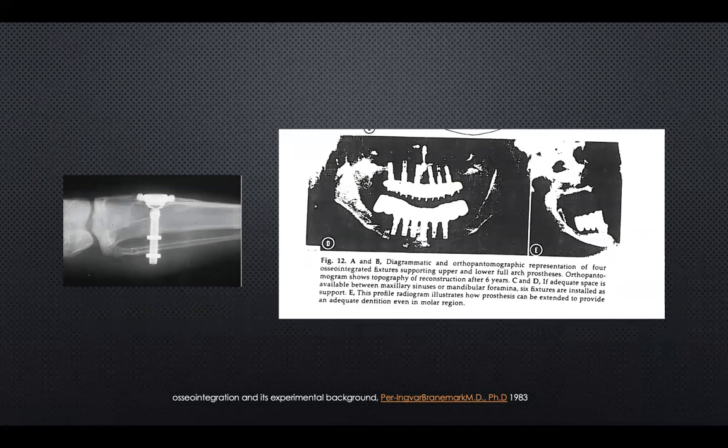And if we take a look at this right now, it looks like the all-on-5 or all-on-6 concepts that have currently come back to the surface. Mainly, when they did their implant placement, they followed the bone, so it was like a surgically oriented or bone-oriented implant placement.